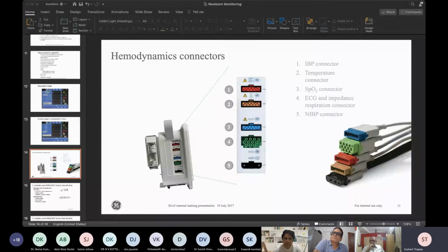It's very difficult to choose. Accuracy also depends on what kind of protocols you have and what kind of patients you have in general. But I would think there's very little to choose between these technologies. With Masimo, the focus also is on movement, which I think some people prefer for that reason. But there are no specific algorithmic differences in terms of how these technologies work with GE and Philips. These are just proprietary technologies. That's what it is.